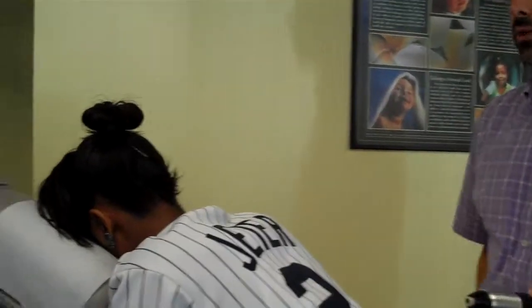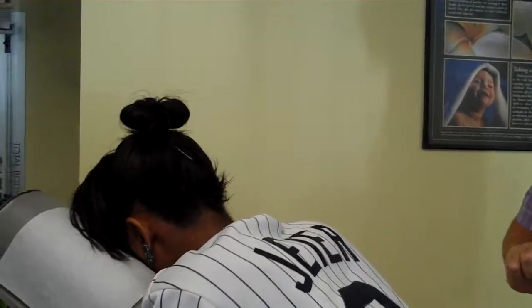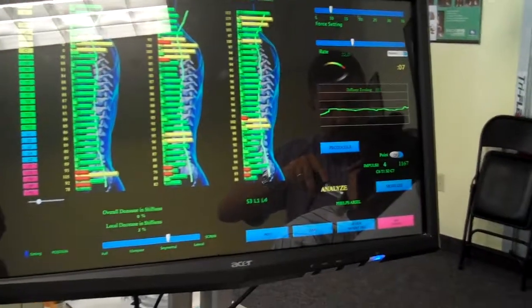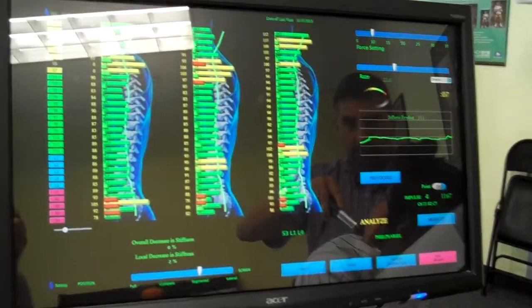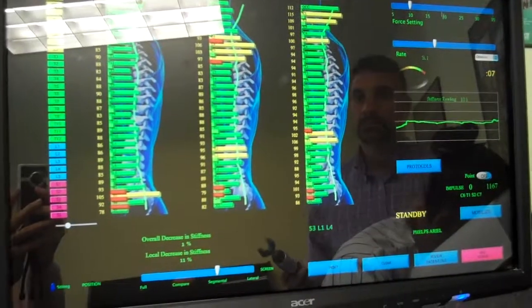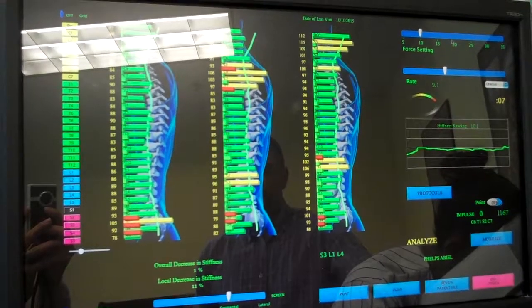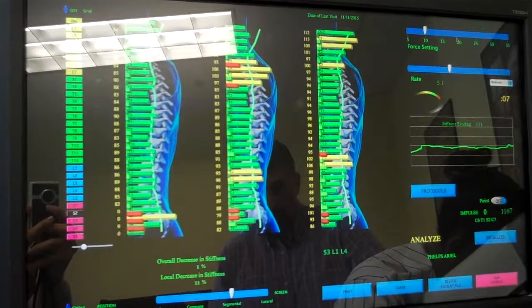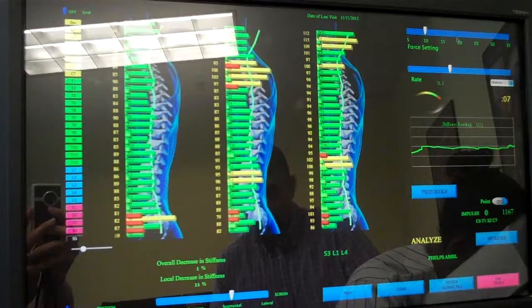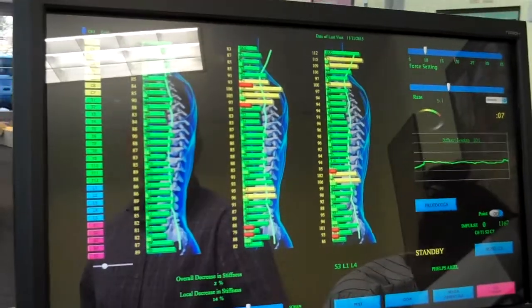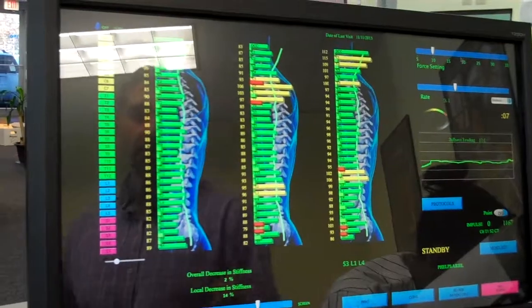Now we're going to go ahead and reanalyze the cervical spine, where we had those components where there was a lot of restrictions remaining. And you can see an amazing change now with a decrease in 14% stiffness.